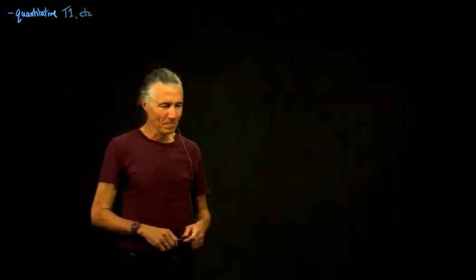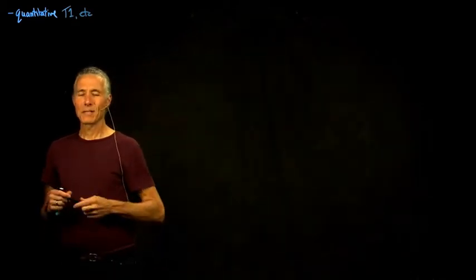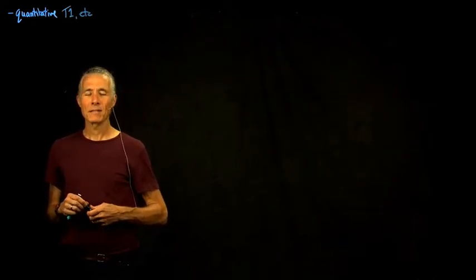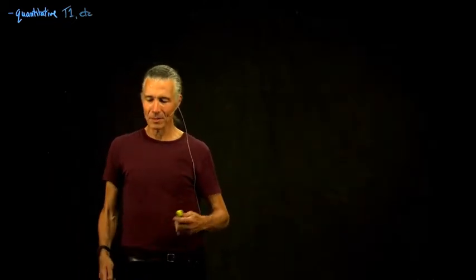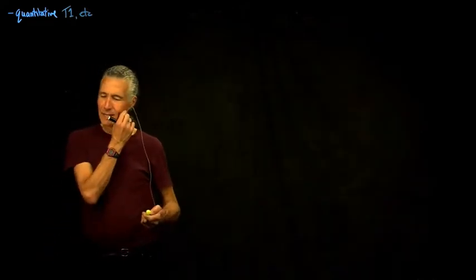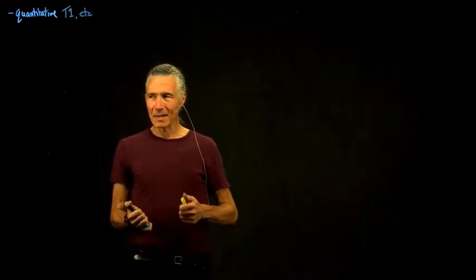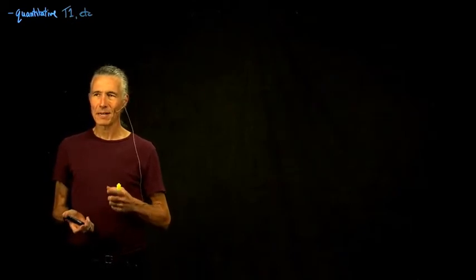Okay, so today I'm going to start off with talking about quantitative MRI, quantitative T1, quantitative T2, because we've been talking about T1 weighted, T2 weighted, but we didn't actually come up with any numbers, because the images come back from the scanner, but they're not actually the T1 value or the T2 value.